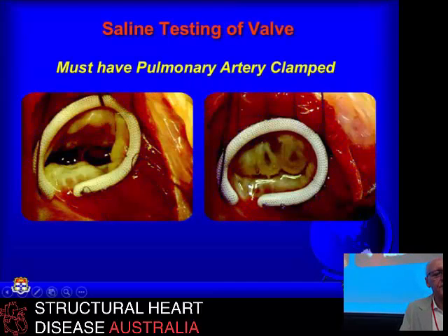This illustrates the tricuspid valve with the annuloplasty ring already in position with the heart open. You squirt saline into the ventricle with the pulmonary artery clamped, and the leaflets coapt quite nicely. This approach can be used when you're trying to identify parts of leaflet that are prolapsing, that have ruptured segments, or deficiency. If you put the annuloplasty sutures in before, you can adjust the shape of the annuloplasty. This is a standard anatomical annuloplasty — some of these valves end up better if they're round, so you can use a non-rigid annuloplasty device. It has to be individualized.